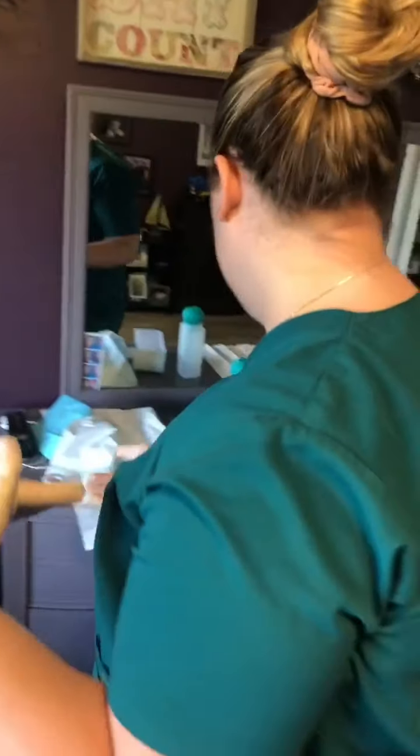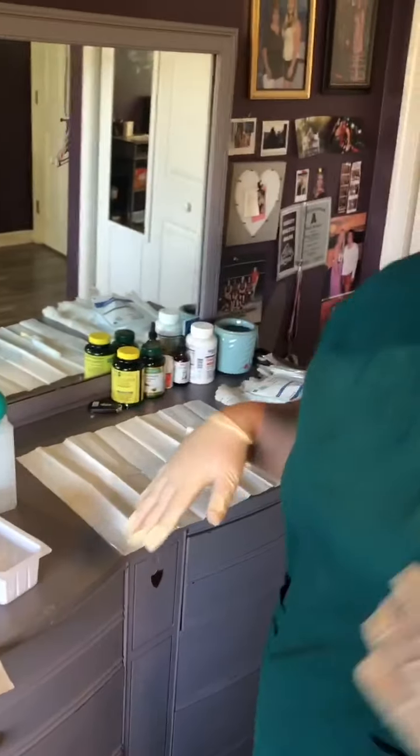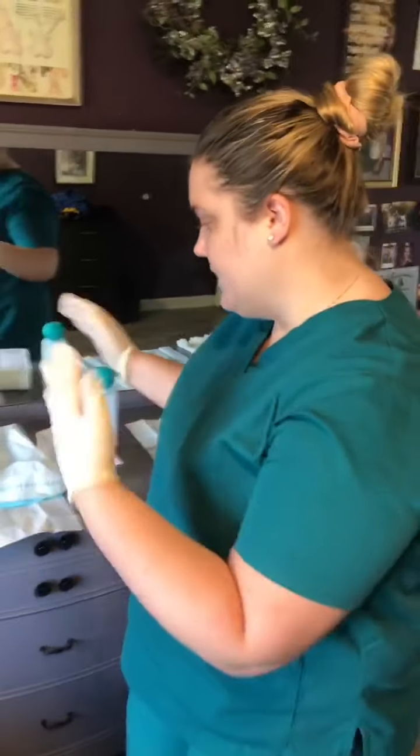I would document that I irrigated the wound, that I performed wound care, how they tolerated the procedure. I would also document that I redressed the wound with 2 4x4s inside, 2 4x4s on the outside, and then an ABD pad, the date, time, and then I would send my culture to the lab.